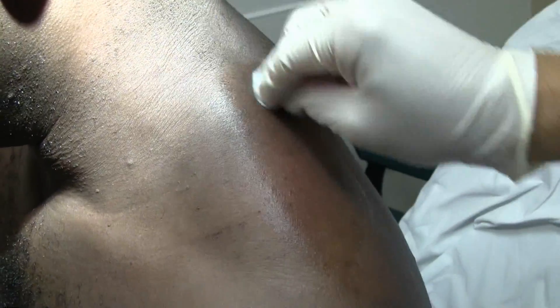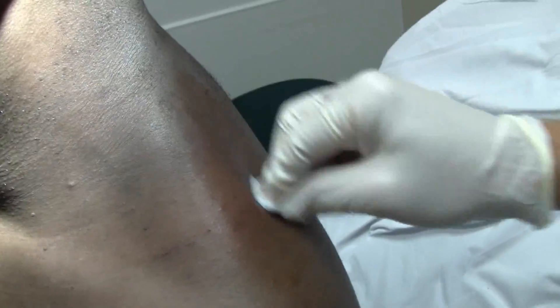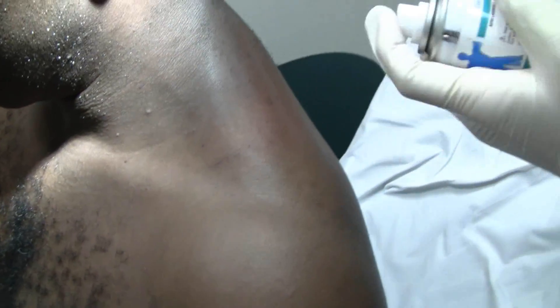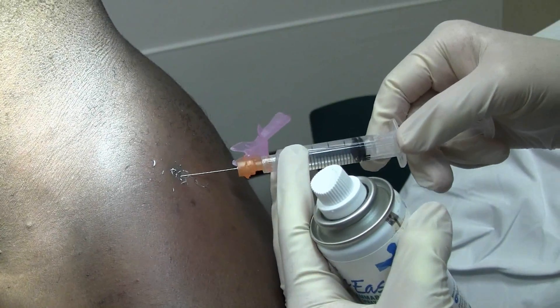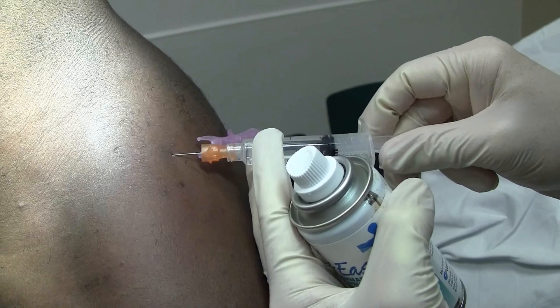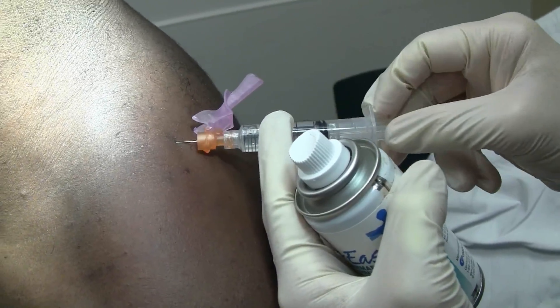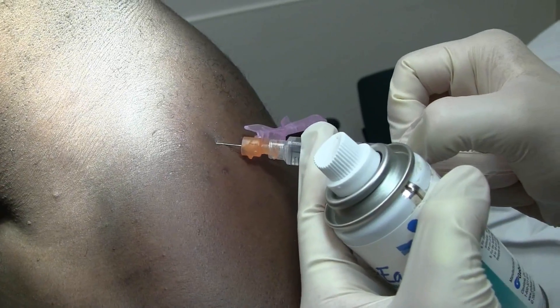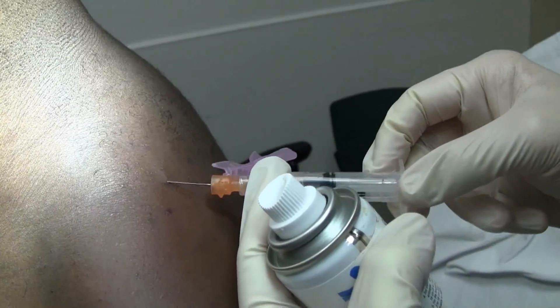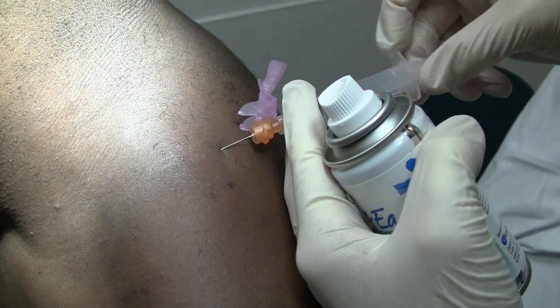We're still going to inject in the areas where it's improved, and we're going to do probably at least two injections. We're going to fan the needle back in several different directions as we deposit the steroid and the numbing medicine. I usually don't aspirate because I'm moving back and forth so fast — my process is I fan it back and forth. But it does make sense if you're going to deposit any amount in one single location, by all means aspirate back.